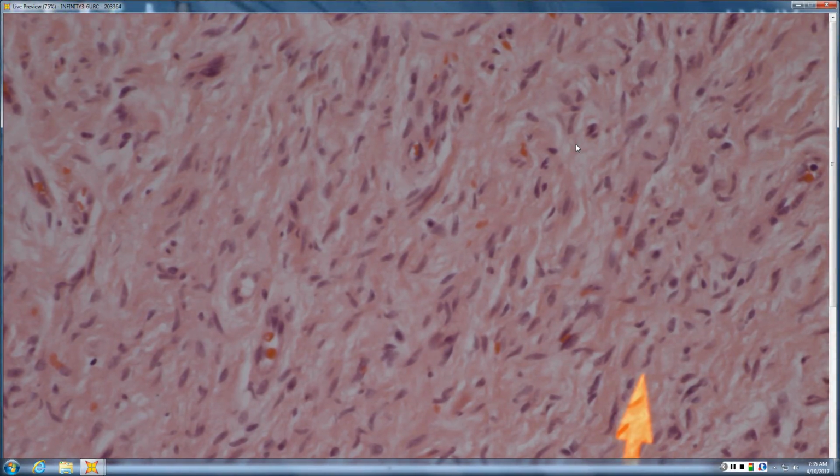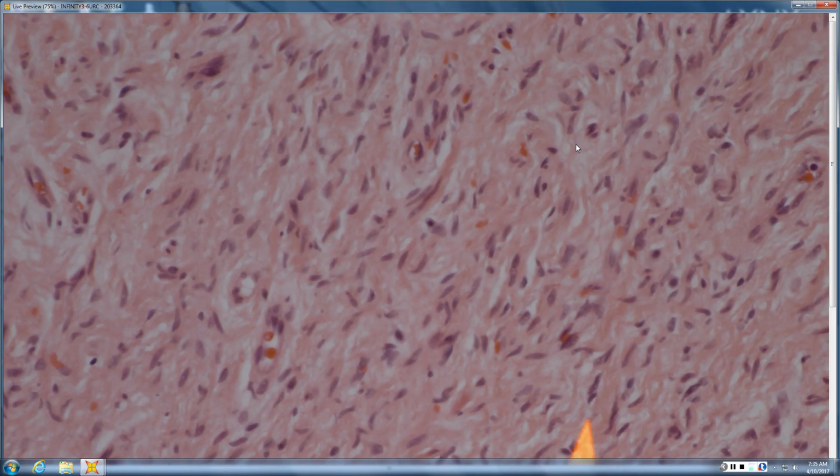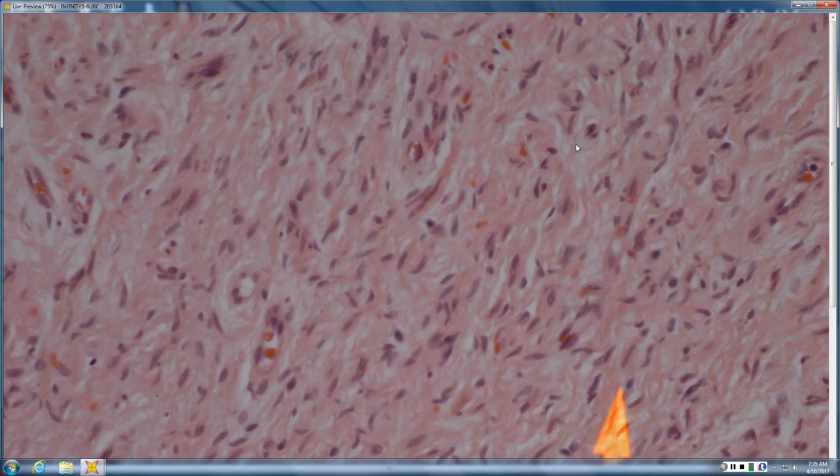Okay, so what features are we looking at? I'm just confused, sorry. Just looking at the higher power features, it was not meant to be tricky. So we see mast cells, and we have sinusoidal, kind of S-shaped nuclei, which are good for NF, so that's fine.